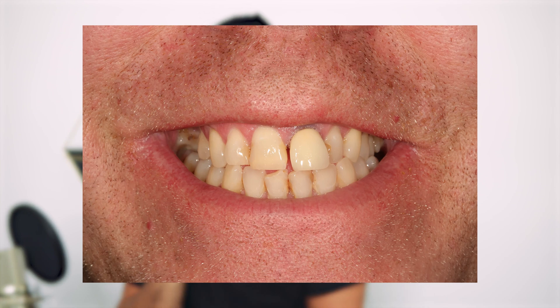Let's have a look at this case. This guy came to see me because he had problems with this tooth, and you can see it just doesn't look very good. But it wasn't so much the look — he'd kind of lived with that for a long time. He'd knocked the tooth when he was younger, had a whole lifetime of treatment on it, and now it's at a stage where the crown keeps coming off, but the root of the tooth is still in there.